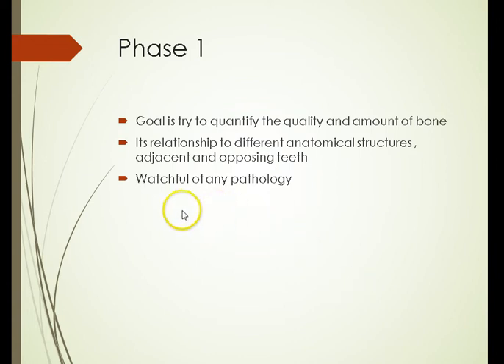And also, it happens to me so many times that you find some type of pathology. A lot of times patients come in with PAs, you take a pan, and there's a cyst right next to the tooth or whatnot. It gives us a good idea what the pathology of the patient might be.